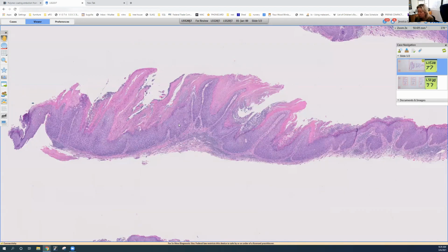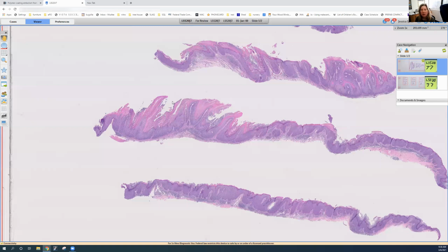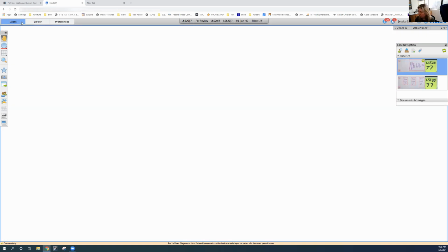We now have commercially available antibodies to identify the low and high risk HPV subtypes associated with cervical dysplasia and neoplasia, and so we can perform those on skin biopsies. There are many, many more types of HPV that occur in the skin than are looked for in that assay. So if you're just looking for HPV types in a run-of-the-mill wart, we really don't have any commercially available antibodies to look for those. And I think that's all I wanted to say about this case. Moving on.